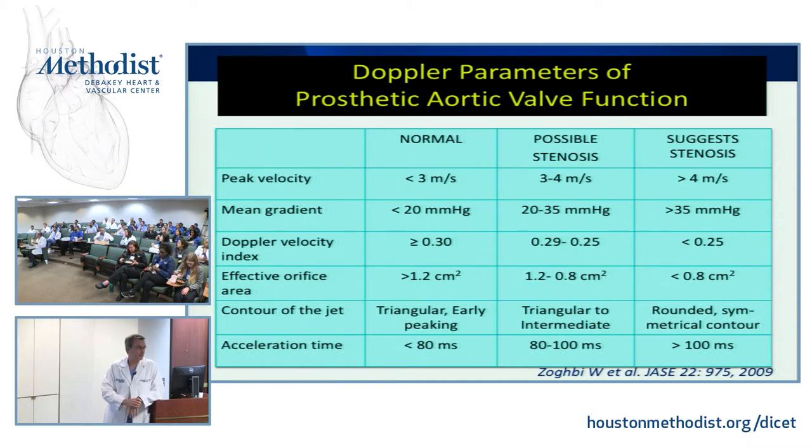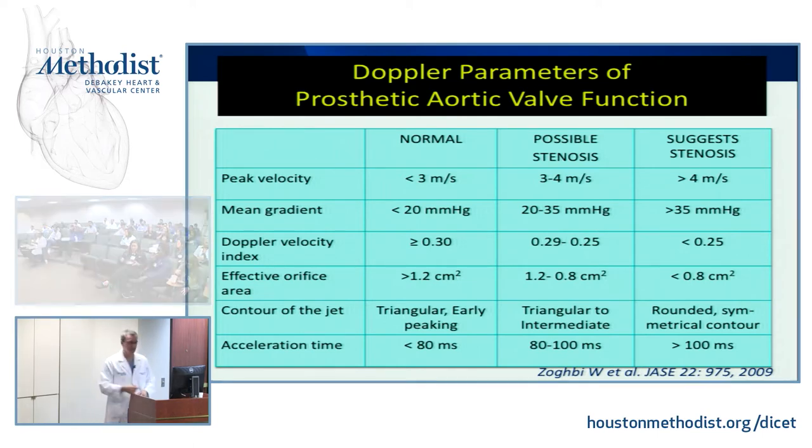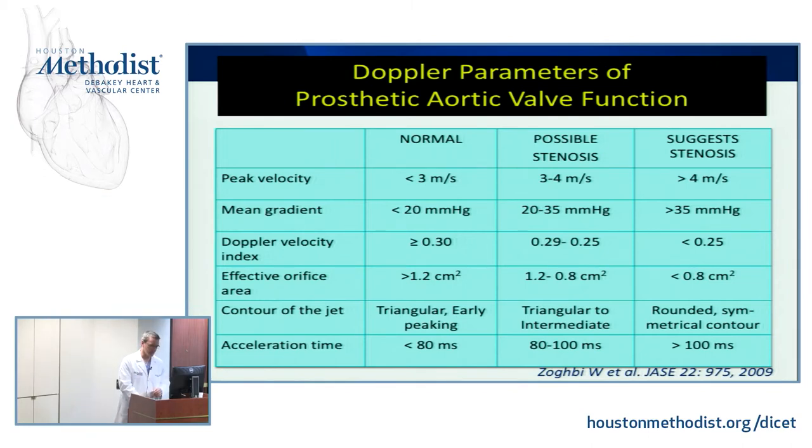Practically, it's very difficult to get that echo back into our system to have it available for comparison, so we tend to do a pre-discharge echo, and it really should be pre-discharge. The ideal is the day before they go home. It's not, you know, post-op day two in the ICU. That's an okay echo to exclude a tamponade, but that is not the echo that should be used for their benchmark. So it's unfortunate that we get that too often. It really should be the pre-discharge echo, and not the day of discharge, because if you find a hemopericardium, which sometimes happens, you've lost all that. So the ideal time for your echo is the day before discharge. Well, the ideal time is 30 days, but the practical time is the day before discharge.